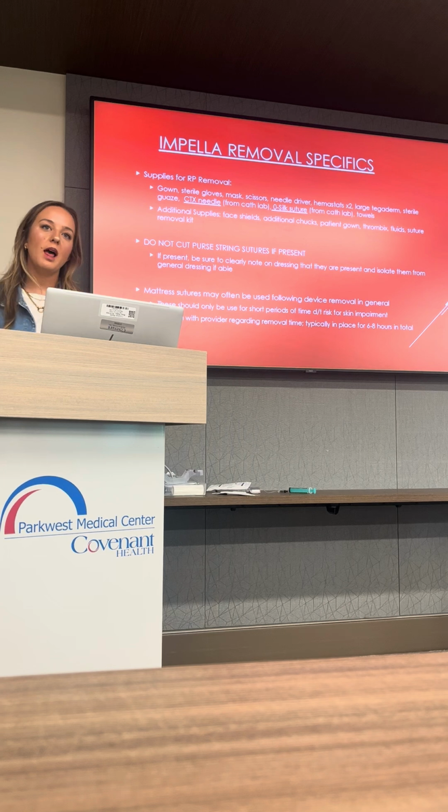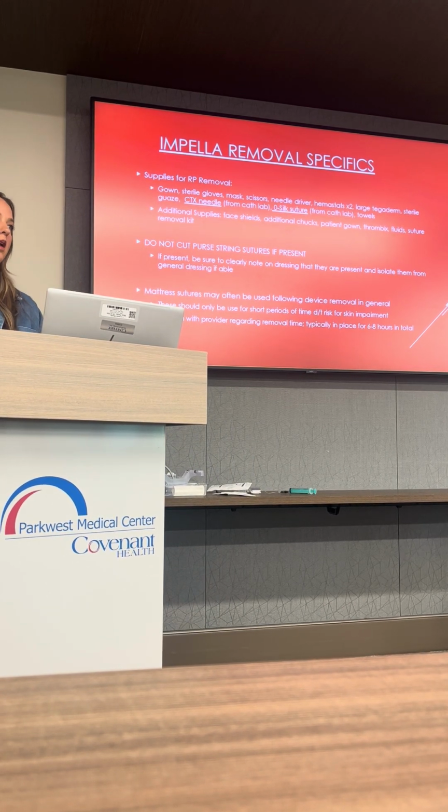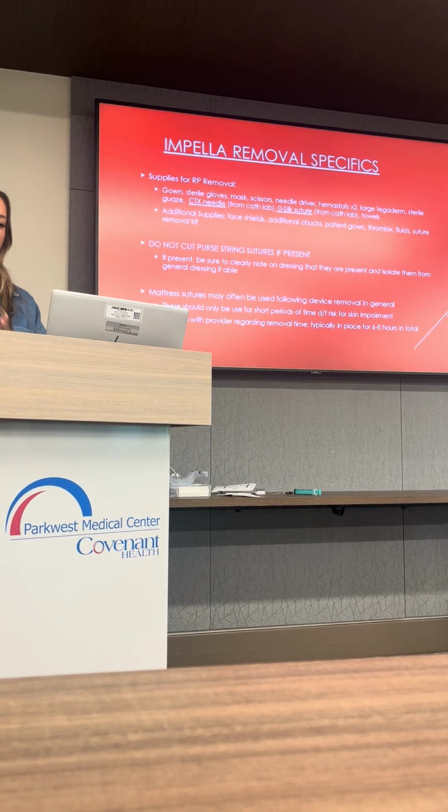Document it on the patient's leg. Make sure the dressing clearly states that. Make sure you've said that in report. Make sure, even if you're going off to lunch and someone's watching your patient, you mention that that's in place and that that's the purpose of it.